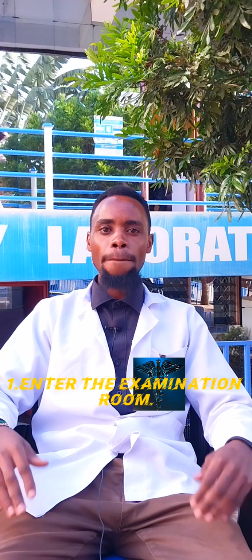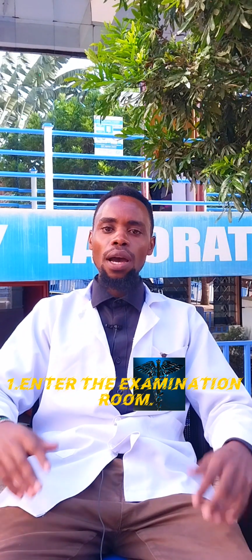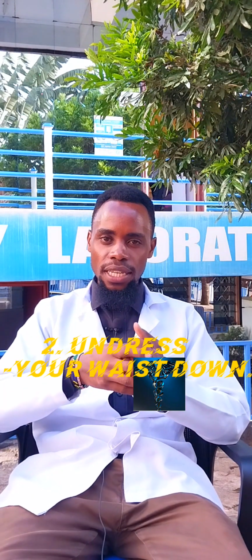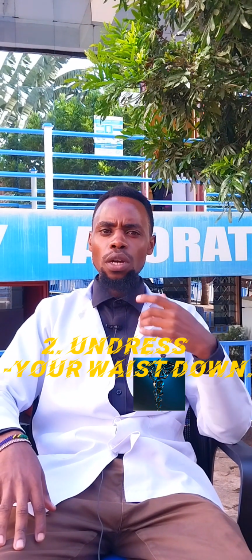Once you come to our private room, or we call it the examination room, you are required to undress, that is to remove your clothes from the waist down. So you are required to just undress, toa nguo zako zote. And when you are coming for cervical screening, you are not required kuvaa kijeshi kama mtu anaenda kwa vita. So you are just required to wear light clothing, and then undress from your waist down, so that daktari anaweza angalia mahali pale.